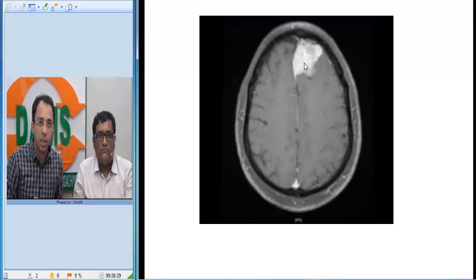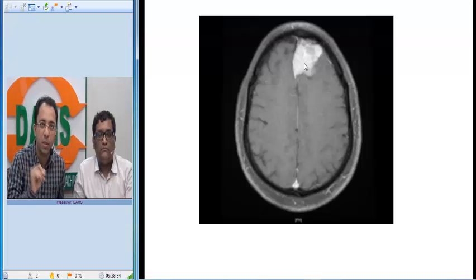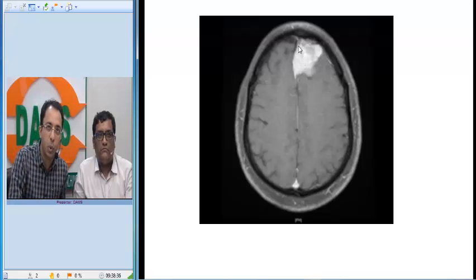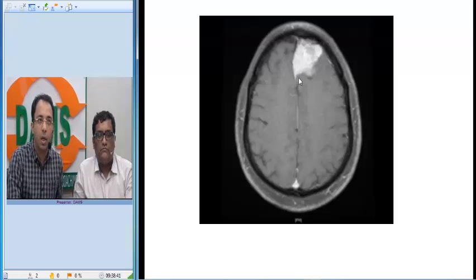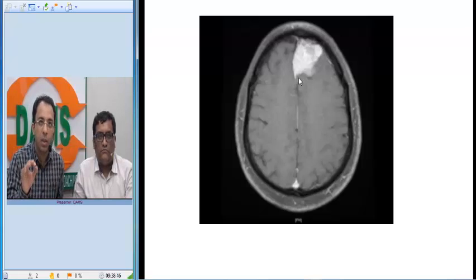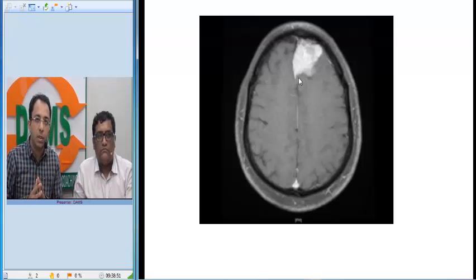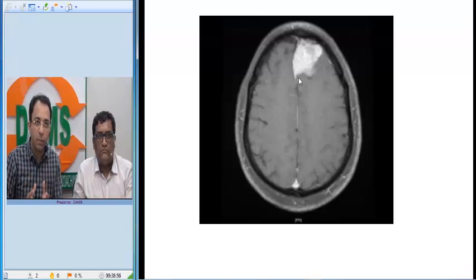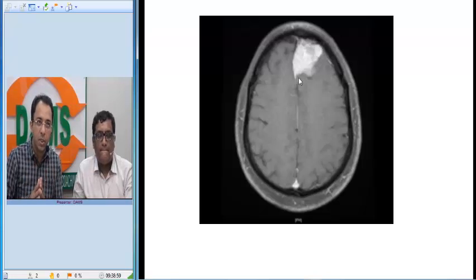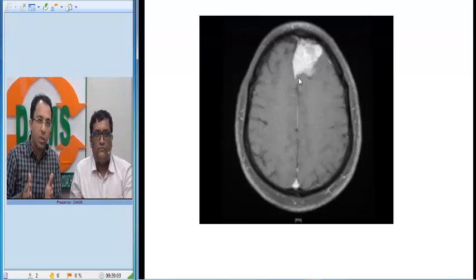In such patients we advise a contrast-enhanced MRI study. On the contrast-enhanced image you will see this tumor is showing homogeneous enhancement with a broad base towards the dura, and you can appreciate the dural tail. Because of the extra-axial nature of the tumor — it is not protected by the blood-brain barrier — it is showing homogeneous intense enhancement.